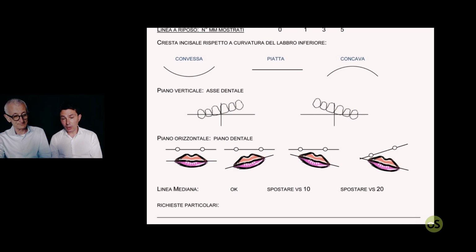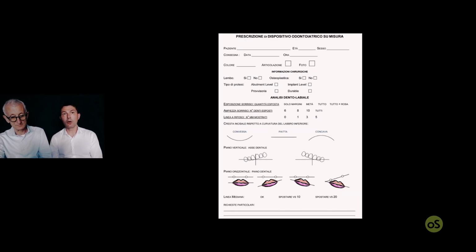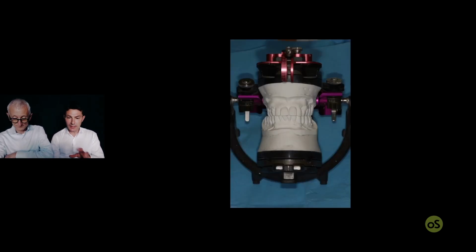Yes, and if it's long lasting or only temporary, because sometimes it is important, because I select a different kind of teeth or different material to assemble the shell. Okay, if this is just a quick temporary, it's supposed to stay for a longer time. This is for the long-lasting restoration. Yeah, let's go.